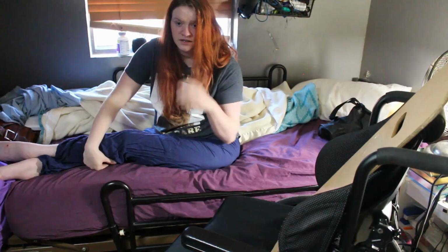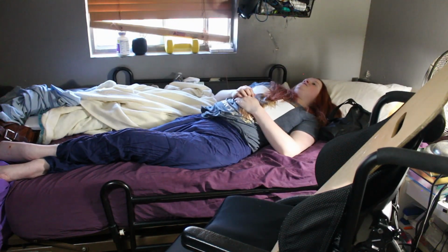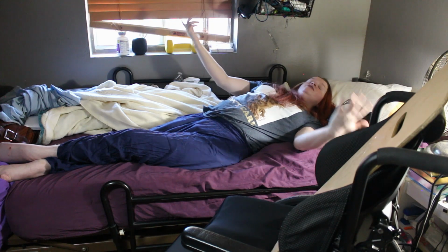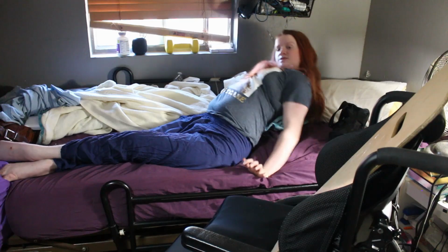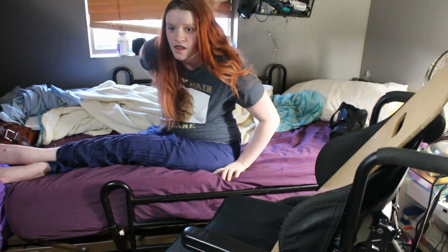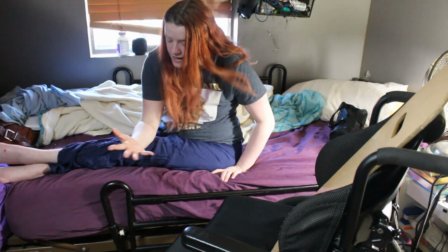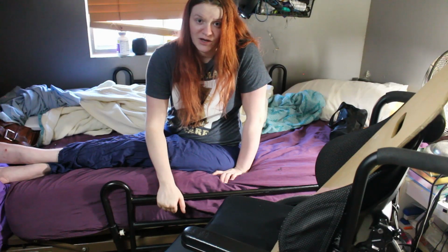And then to get out of the bed, pretend I am lying down. Always keep your wheelchair near your bed, especially if you don't have somebody that lives with you, because otherwise, how the heck are you gonna get out? So then I try as hard as I can not to rely on the railing if I don't have to, because the goal is for independence one day and to hopefully not have to use a hospital bed always.